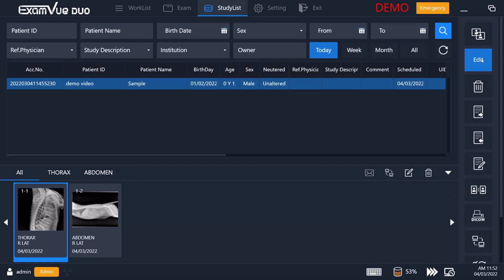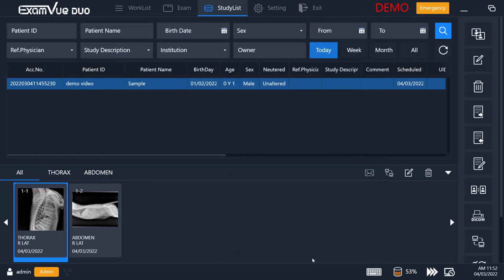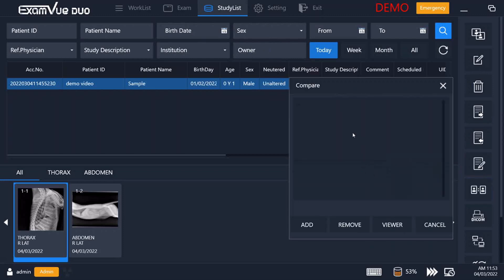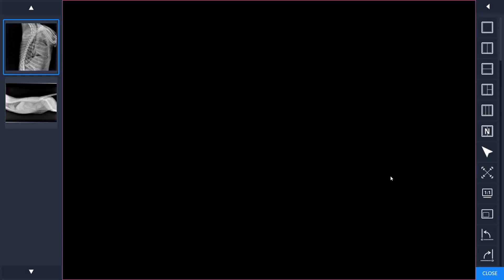You can also edit the information of the patient, delete studies, and import and export studies as DICOM or JPEG. You can do simple reporting that can also be emailed or printed. You can look up your past studies simply by week, month, or all, or by more detailed search using the search bar up top. And you can compare images between any number of studies using the compare button — simply select the image you want to add, go select any other image from any other study, and it will be displayed next to each other in the viewer.